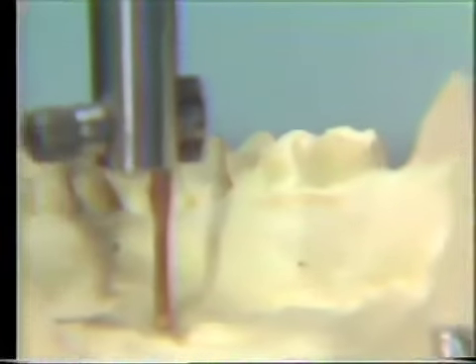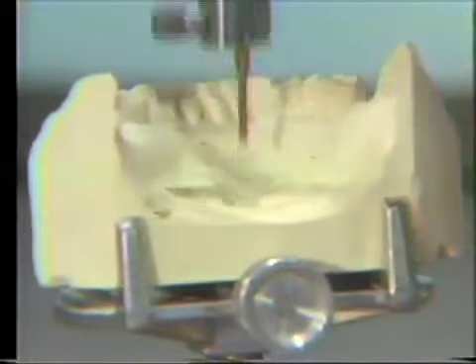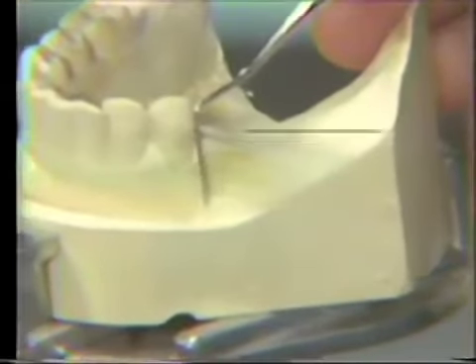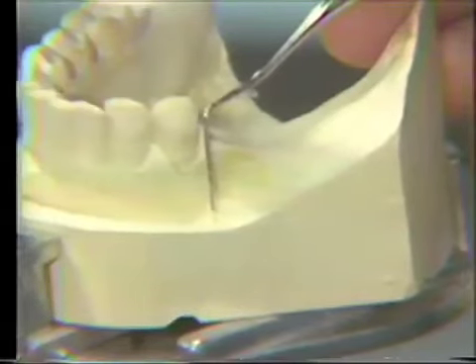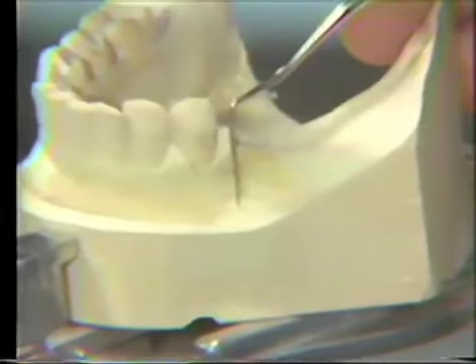And then in this position, the only soft tissue undercut that I have to contend with is the buccal surface of the residual ridge area, this area. This is the only soft tissue undercut that I have to deal with. Now I can relieve the base in that area just that minor amount to get around that undercut.